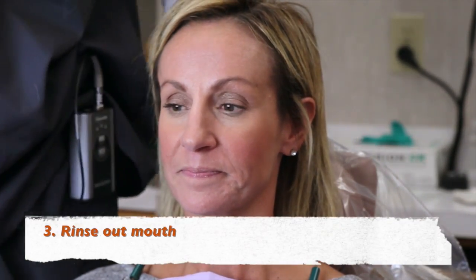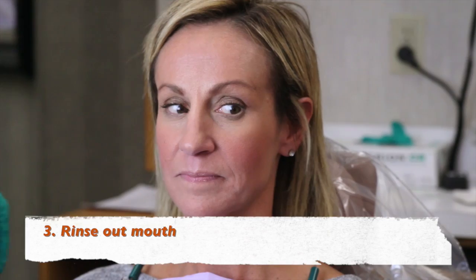And so with that, the last thing we'll do before actually making the impressions is we're going to have the patient rinse out. And we're going to have them rinse with an alcohol-based mouth rinse. And then it's just to remove any little bits of particles of debris or food. I like an alcohol-based because it's lipid soluble. If the patient has had something like a piece of bacon before they came in, it'll eliminate any of the grease or whatever that might be in there.